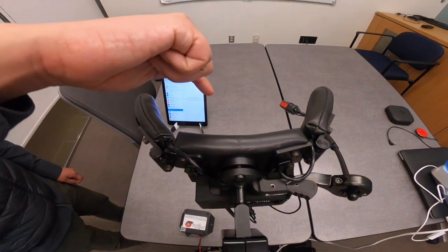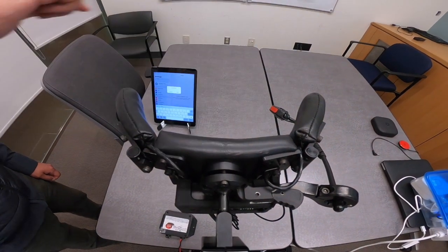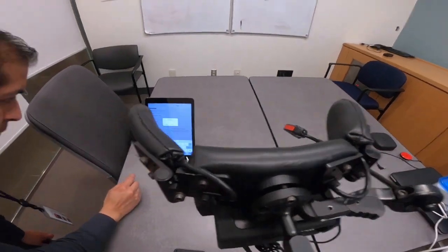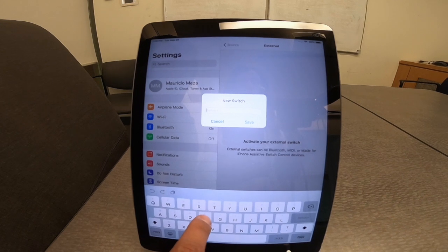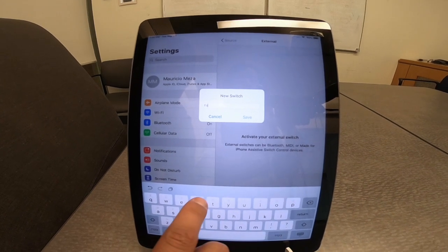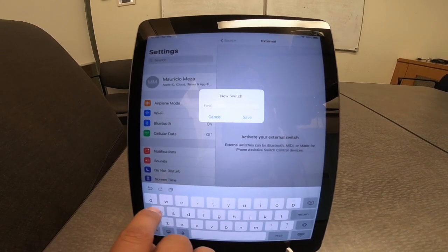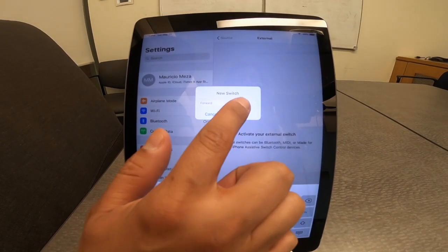Finally, we will program the back head pad, naming it forward. We will use it to select items, but when it is long pressed, it will be the switch to go to the device home page as well.